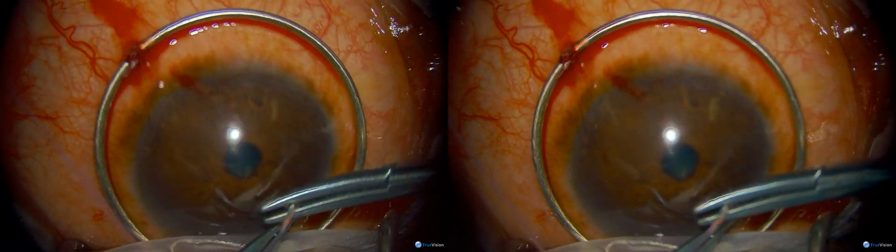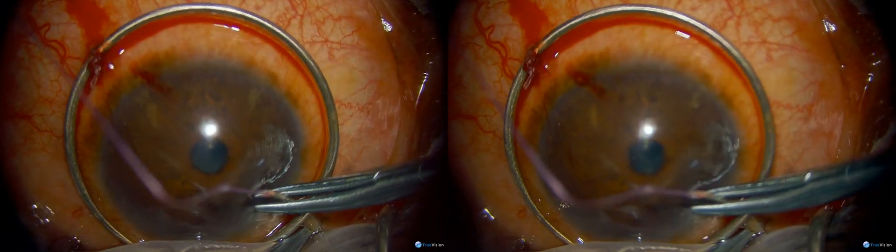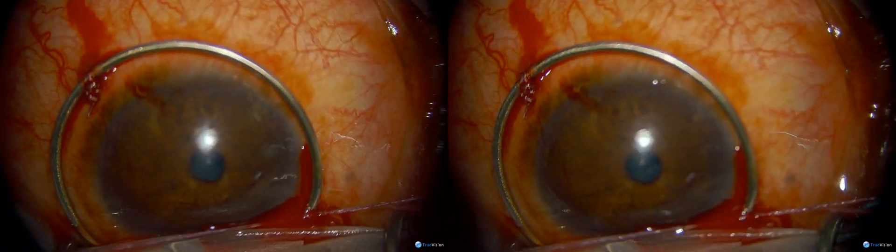Hi, my name is Dr. James Lehman and I'll be narrating this DALK surgery done by Dr. Menon from Addis Ababa, Ethiopia. Here Dr. Menon is passing an episcleral bite to suture down a Fleuringa ring, in case the surgery has to be converted to a PK.